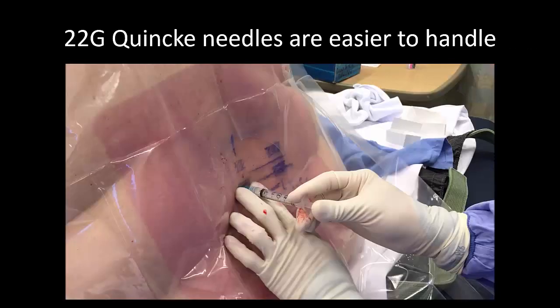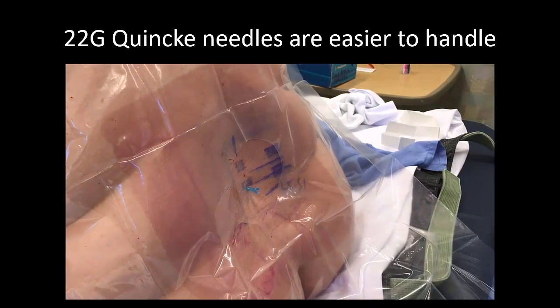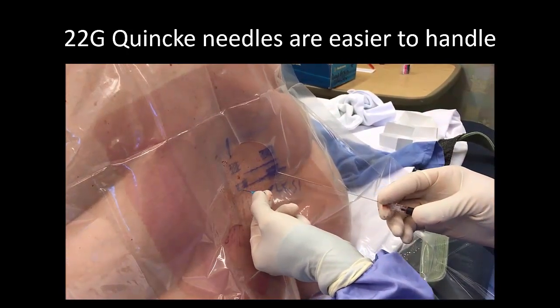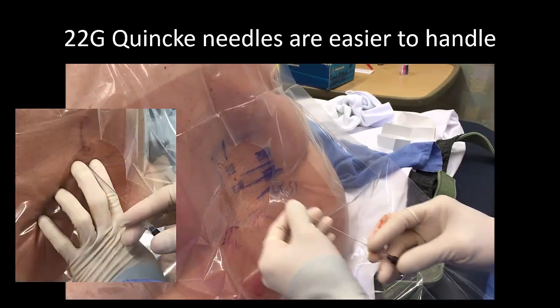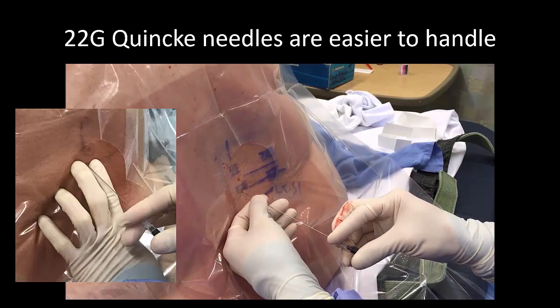A 22-gauge or larger needle has the advantage of being stiffer, less likely to deflect, and thus easier to manipulate in small incremental redirections. Nevertheless, careful handling is still needed. Always use a Quincke tip, not a pencil point, which takes too much force to advance, sacrificing control of the needle. Unlike a regular length needle, two hands are needed for needle stability, and therefore I do not fix the skin with my other hand when inserting the needle.